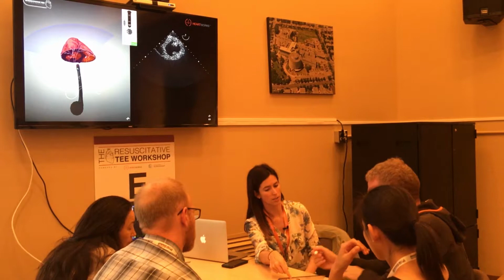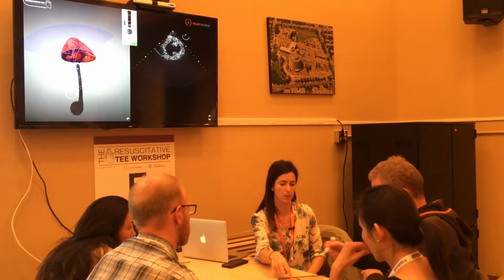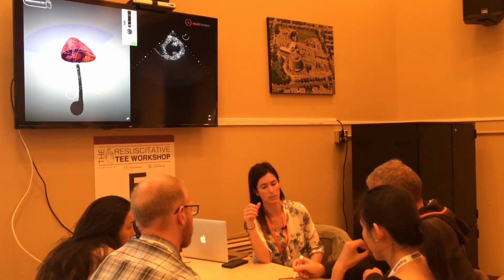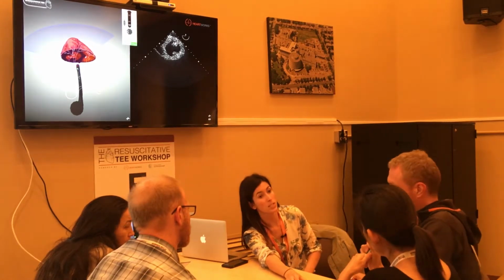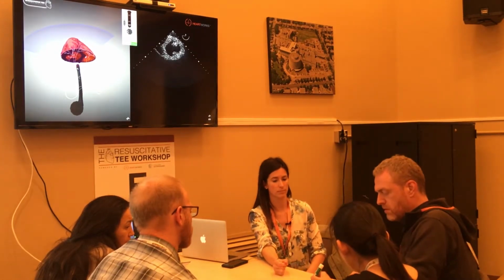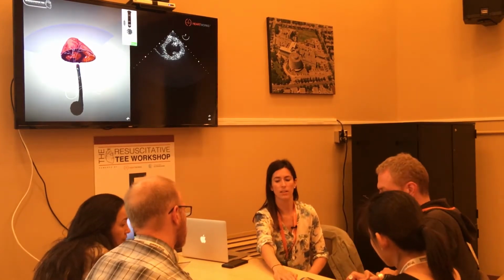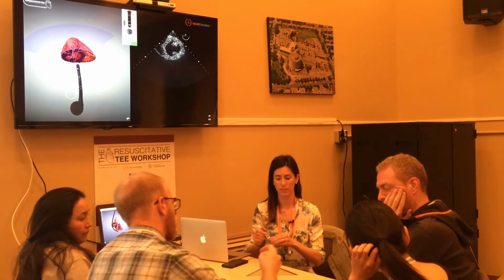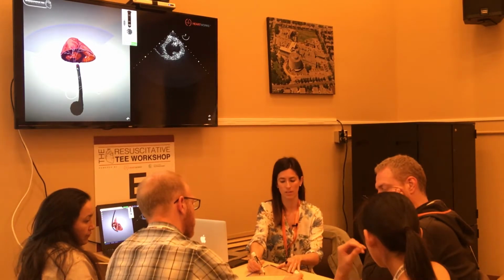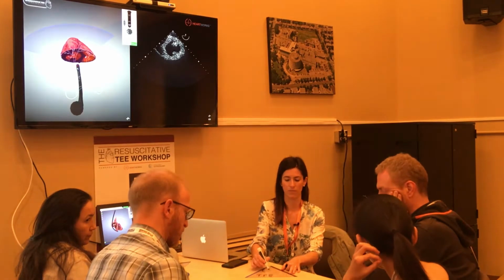Yep, so we're on the septum, we're in the anterior part of the heart. Yep, a little bit over here and a little bit up towards the septum. Perfect. How about the RCA? Excellent. And then the left circumflex. Perfect. All right.